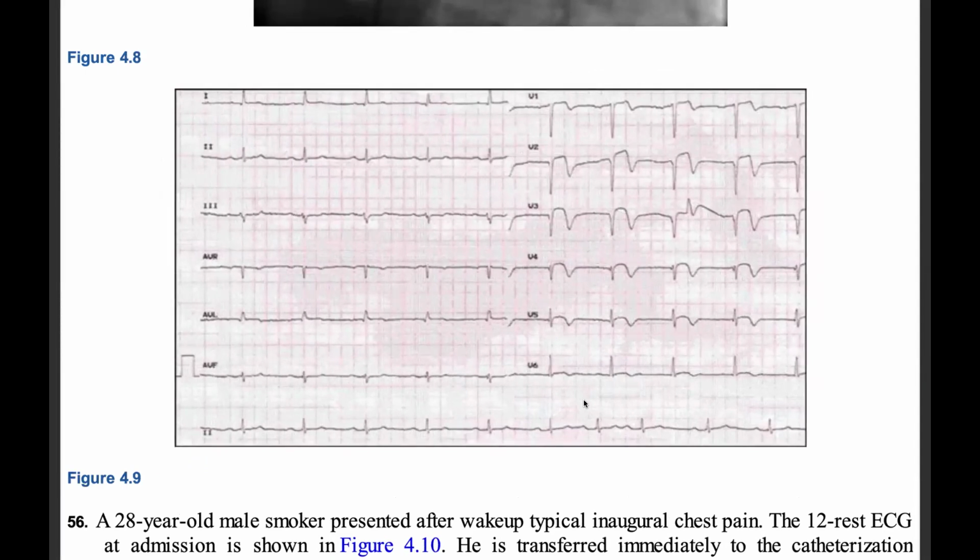Significant findings: we can see there is ST segment elevation in V1, V2, V3, V4, V5 with T-wave inversion still in those leads.